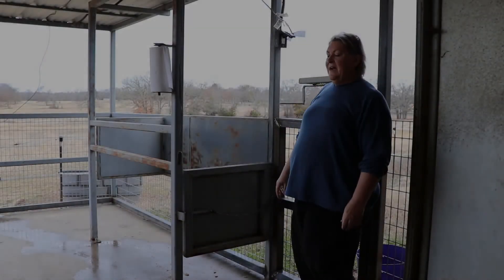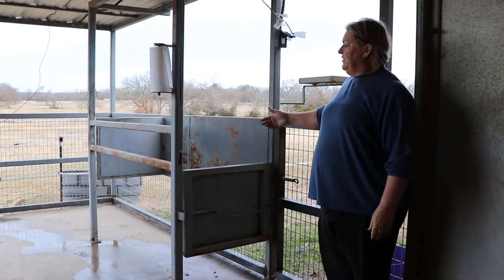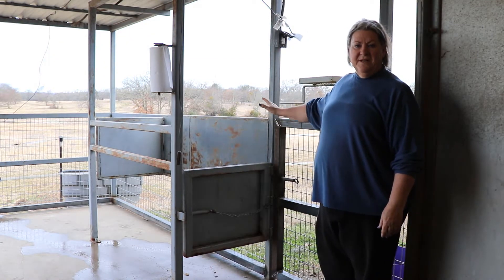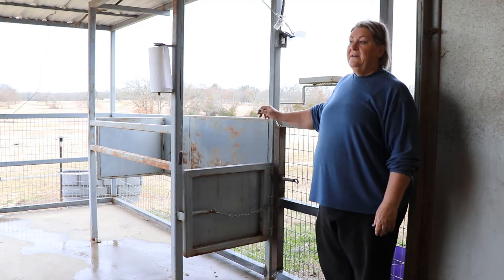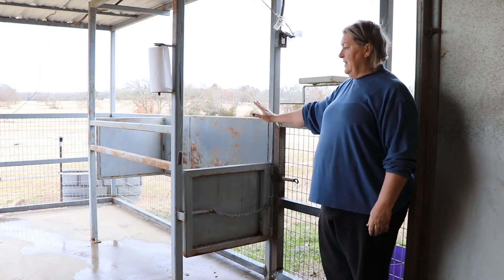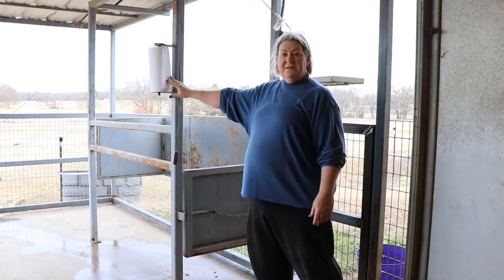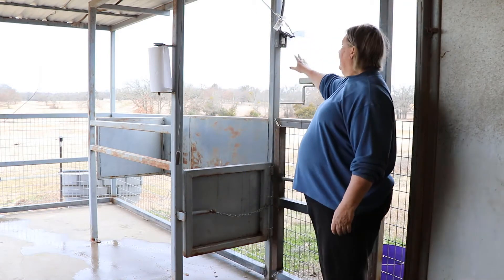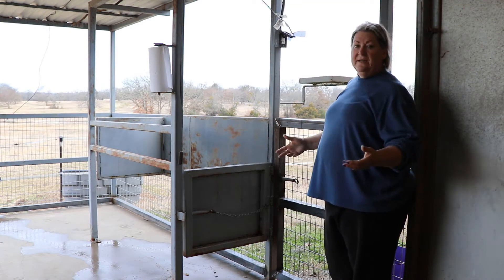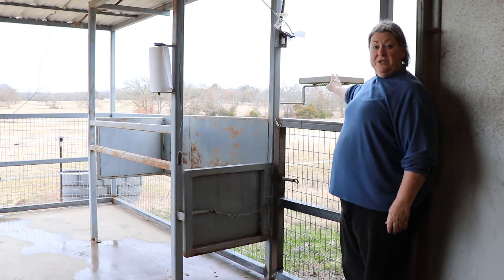Good morning. Right here you see our palpation chute. This is where we bring the mares in for the vet to be able to check them and just see their stage of ovulation, or if we need to do any cultures or anything else with her, this is where they go. We try to make it convenient for the vet. So we have paper towels right here. We've got electrical power right here in case we need to plug in the ultrasound, if we need a light, anything else. We've fixed this to actually hold the ultrasound machine.